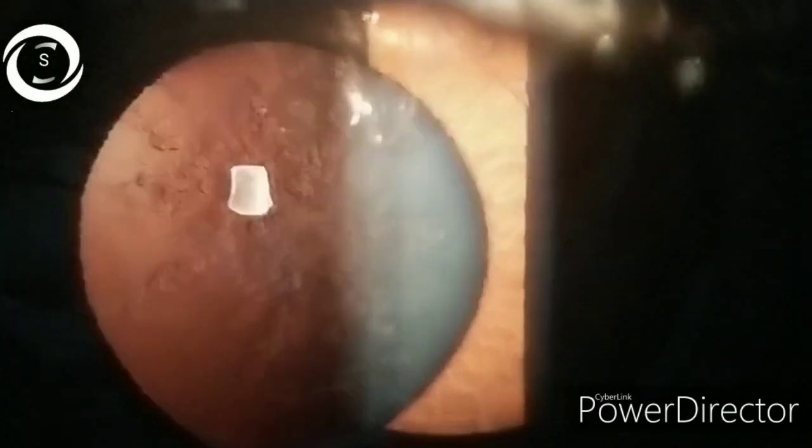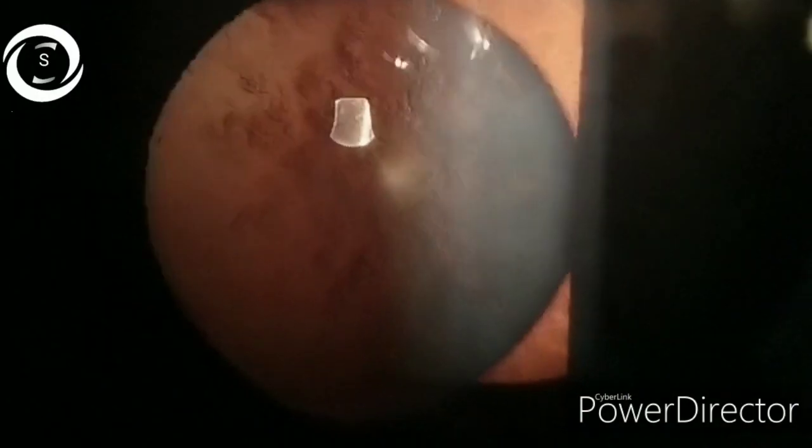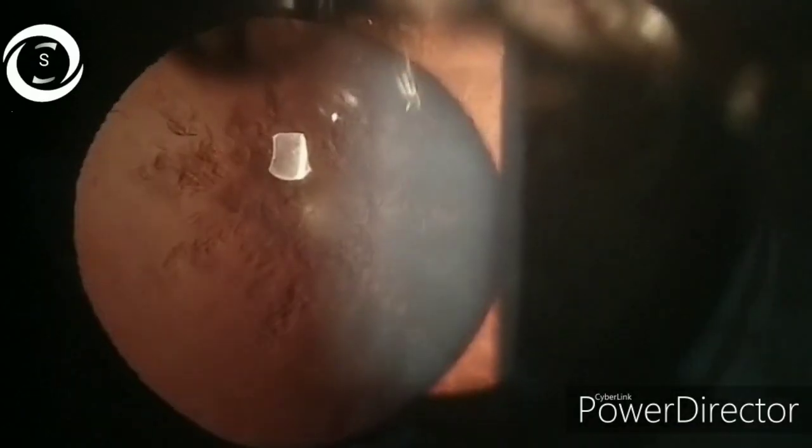Retro illumination is best done under dim room light in a dilated pupil. It highlights opacities in the lens such as cortical cataract, focal traumatic cataract, posterior subcapsular cataracts, polar cataracts, and anterior and posterior capsular cataracts. It also highlights corneal pathologies like corneal edema, striate keratopathy, beaten metal appearance in corneal guttata, and foreign body tracks in the cornea.